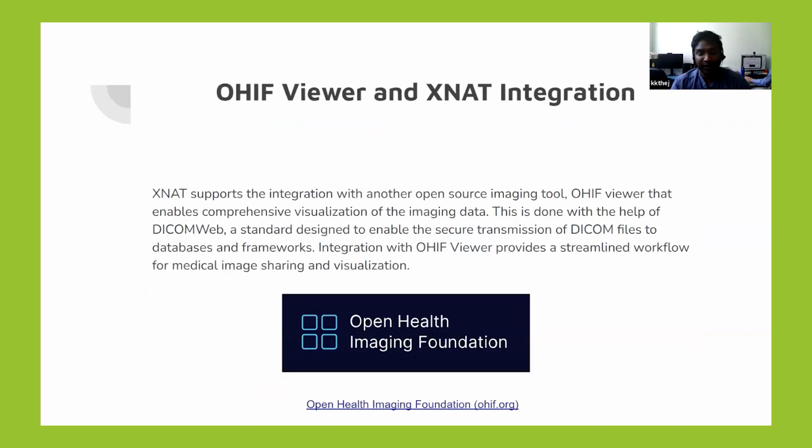So we're talking about the XNAT integration, and I just mentioned the plugins. And OHIF Viewer is one of the plugins. XNAT supports the integration with open source imaging tools. This OHIF stands for Open Health Imaging Foundation. It's a DICOM based viewer.